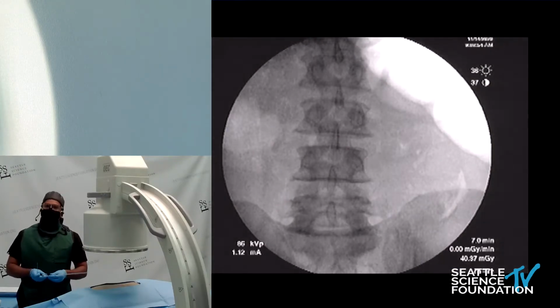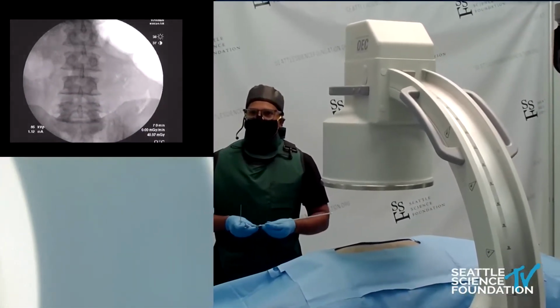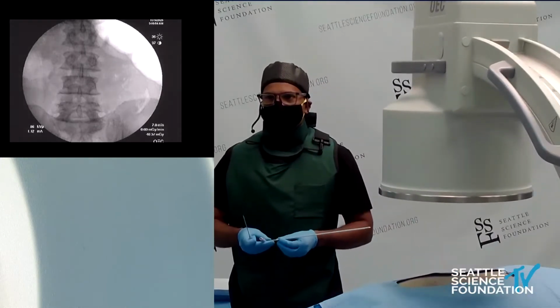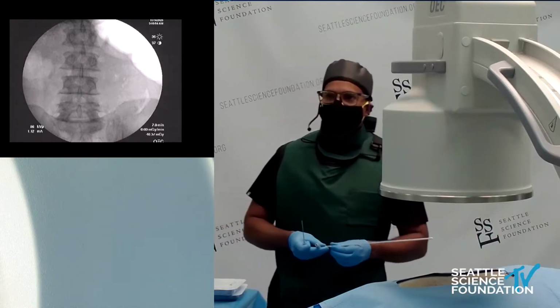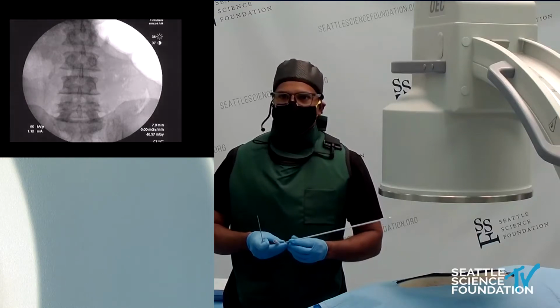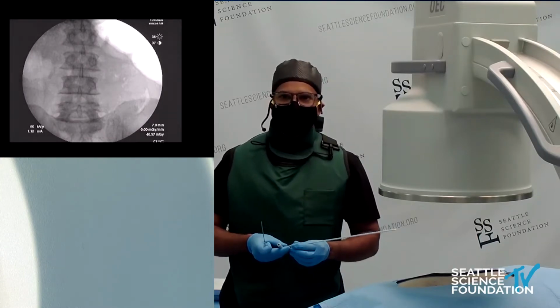So I'm going to talk about DRG stimulation here. As you saw from my presentation, one advantage is that, especially for complex regional pain syndrome, it is superior to traditional spinal cord stimulation. At that time, the ACCURATE study was comparing DRG to tonic stimulation, of course, with newer waveforms. You might see some improvements in spinal cord stimulation, but I'll just tell you from experience, DRG stimulation really is the answer when it comes to CRPS, one of the most challenging conditions we have in our space.